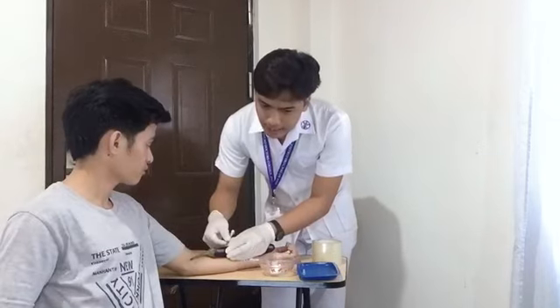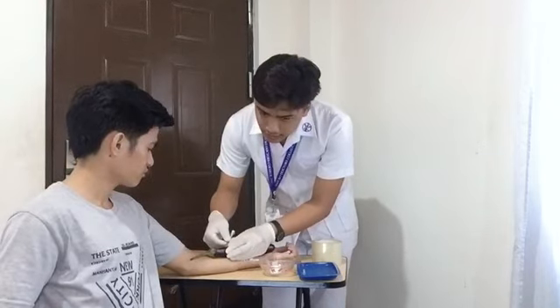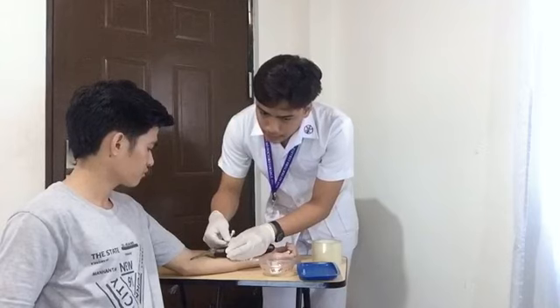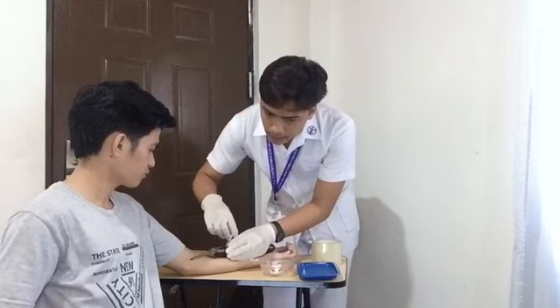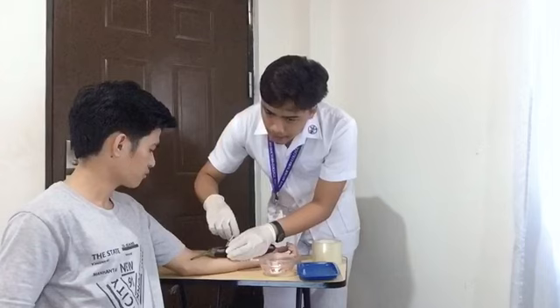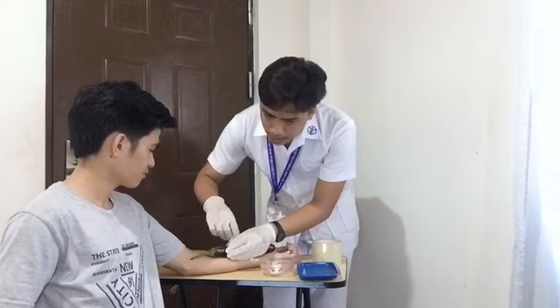Next is stabilize the syringe and needle. Inject the medication carefully and slowly so that it produces a small wheal on the skin. Next is withdraw the needle quickly at the same angle at which it was inserted. Activate the needle safety device and apply bandage as indicated.